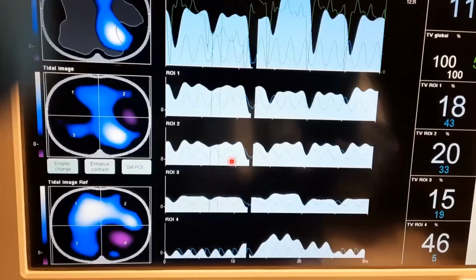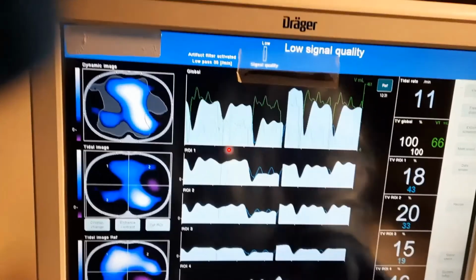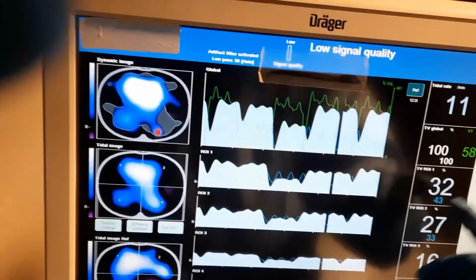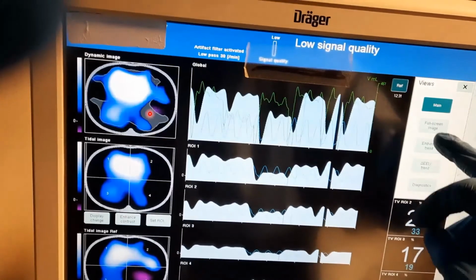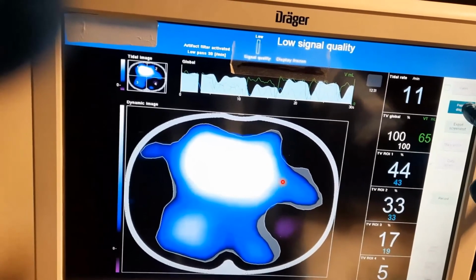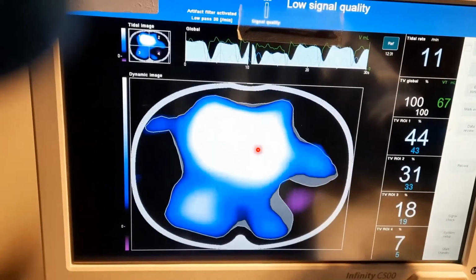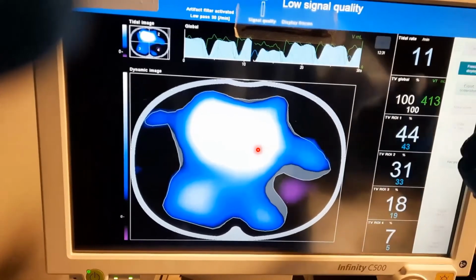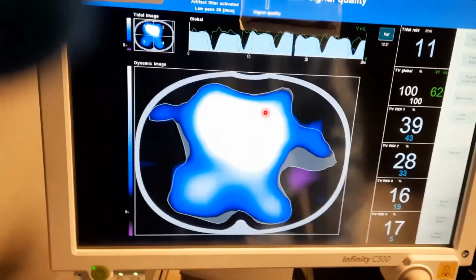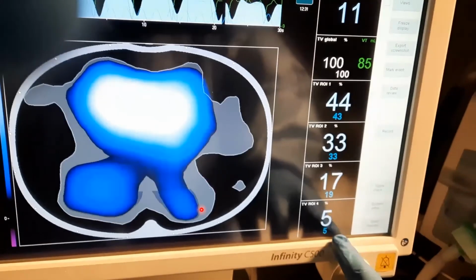So over here, you see that the higher mean pressure that we can get with APRV is actually successfully starting to push back against the pleural pressure here. And we're getting pretty good distribution of ventilation. The white here indicates that there's still a good amount going to the ventral areas, but we could do two things. We could wait it out and see if this white starts to become more uniform. Already we see some white going down to the dorsal areas, or we could play it safe.